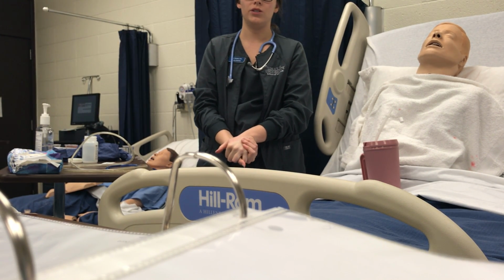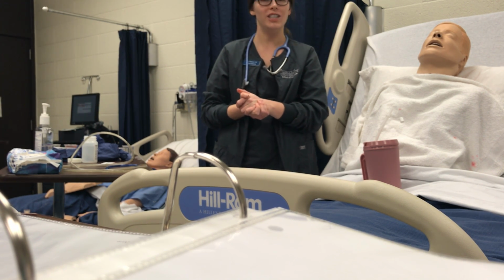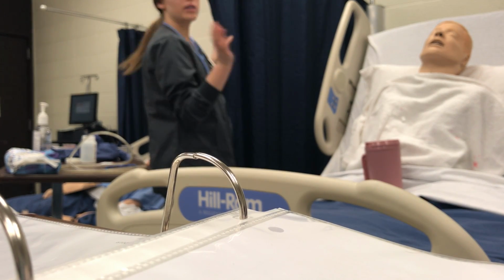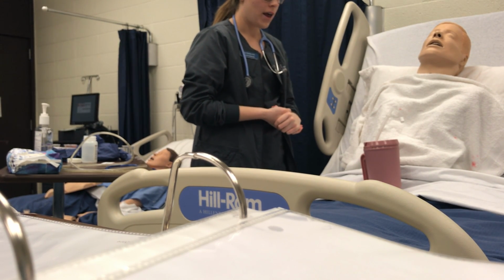I'm a 7th semester nursing student and I will be demonstrating how to place an NG tube, how to administer medication through an NG tube, and how to remove an NG tube. So I'd start off by walking to the client's room, providing privacy. I'd introduce myself. Hi, my name is Abby. I'm going to be placing an NG tube on you today.